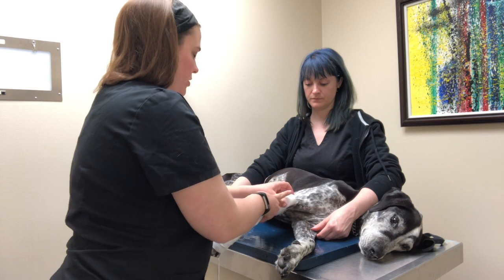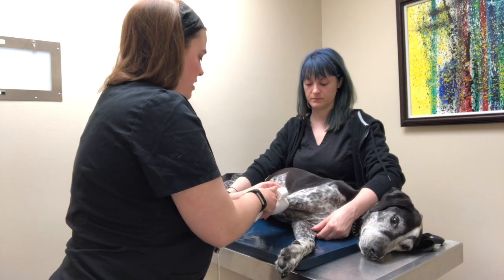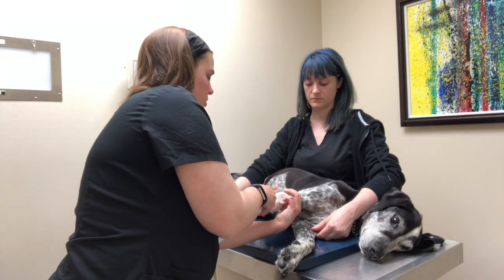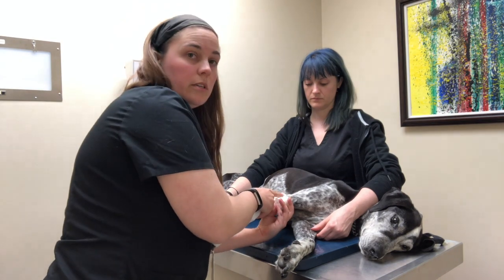With the modified Robert Jones bandage, we want to do 2 layers. It's not as thick as the regular Robert Jones bandage, which is about 3 to 4. So that one's a lot thicker than what we're going to do right now.